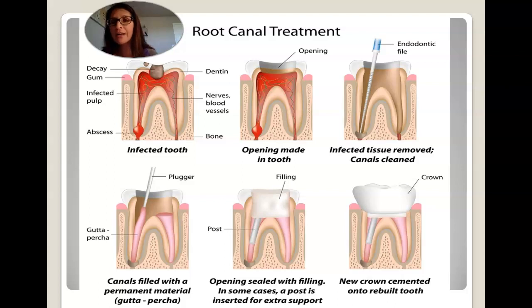And the second one is to prevent any of these chemicals from going into the patient's mouth. So we talked about different methods of moisture control in DEA 102, and the one we're going to be using in endodontics is what we call the rubber dam or the dental dam. That helps to, one, isolate the tooth, provide good moisture control, and also prevent things from going into the patient's mouth.